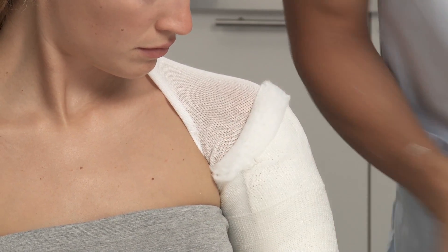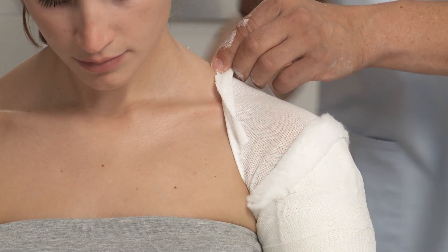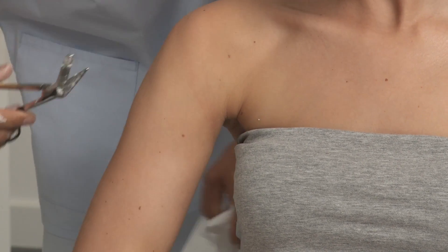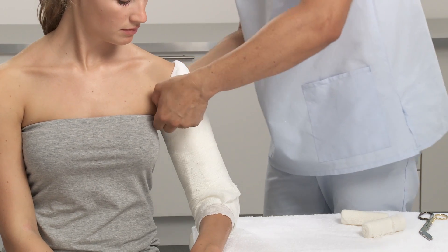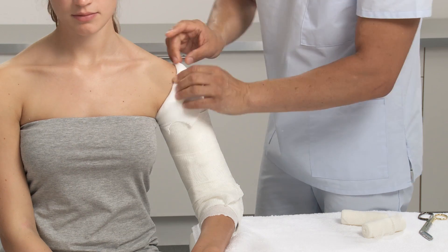Remove the part of the stockinette that secured it in place by cutting it. Fold down the arm stockinette at the proximal and distal ends. Smooth edges provide skin protection and comfort.